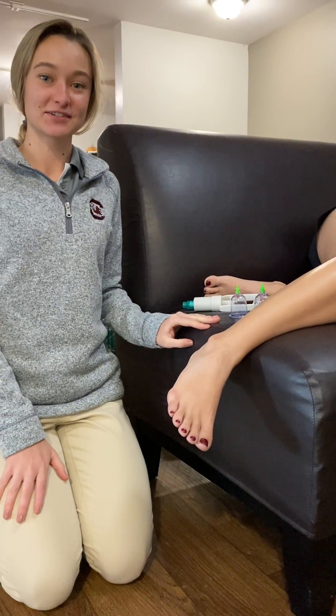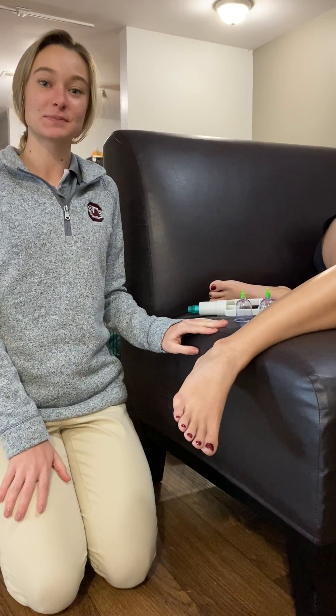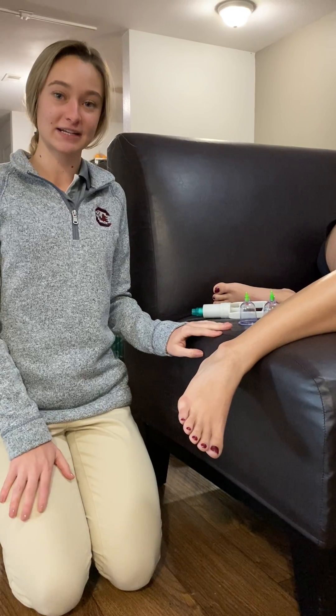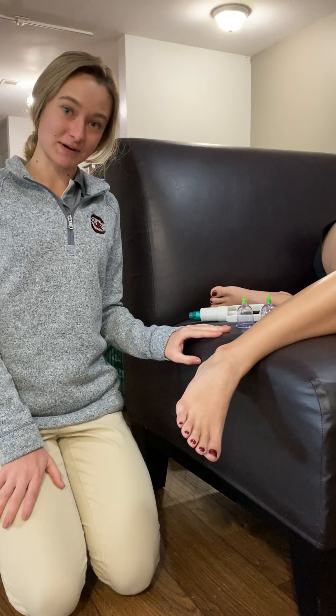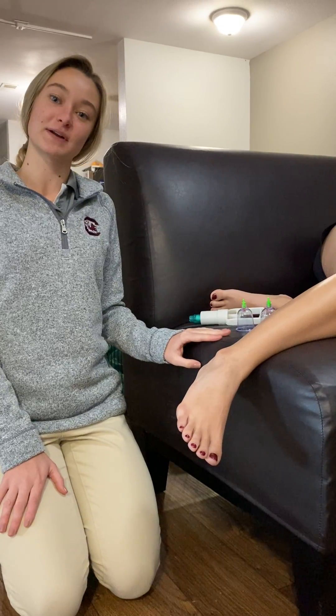Hi, my name is Jillian Shaughnessy. I am a first-year post-professional master's athletic training student at the University of South Carolina. Today I want to show you all about myofascial decompression using cups.